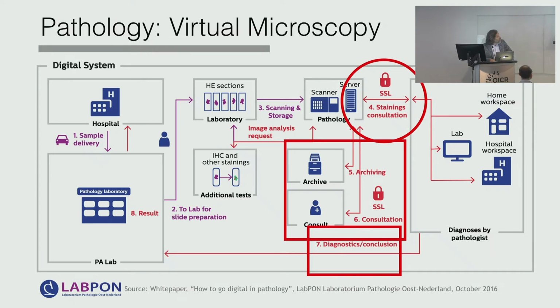However, for those archives and servers, you need massive infrastructure. This is not something for the computer scientists or for the pathologists. This is something for the administration of the hospitals to cope with. So yes, we know that it's beneficial perhaps here and there, but who will pay for it to go digital? You have to invest in that. And then the natural question is, what is the return on investment if I go digital?